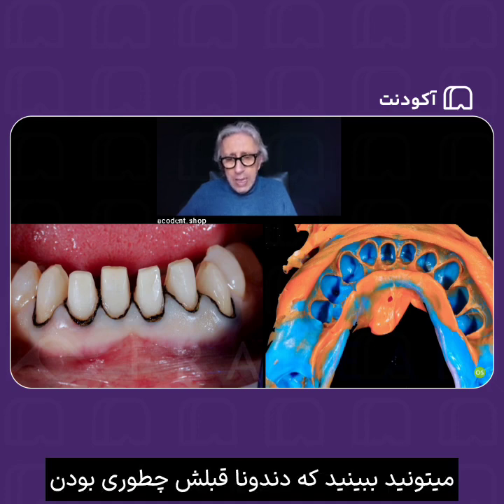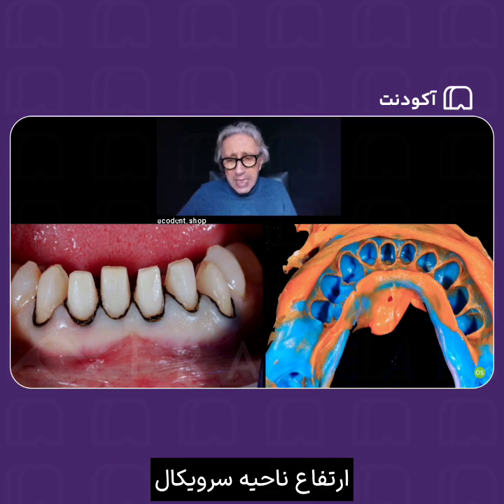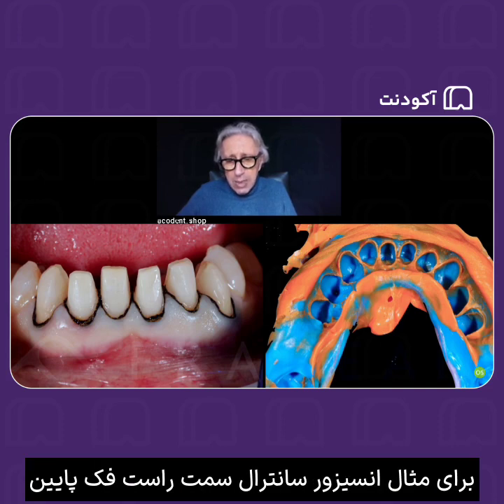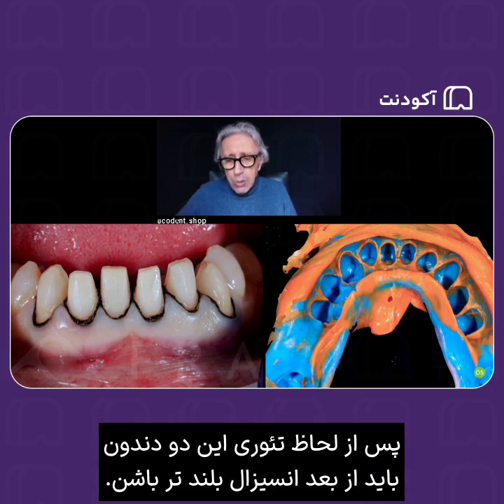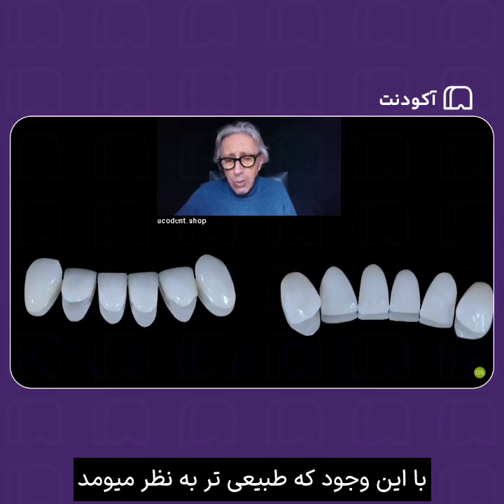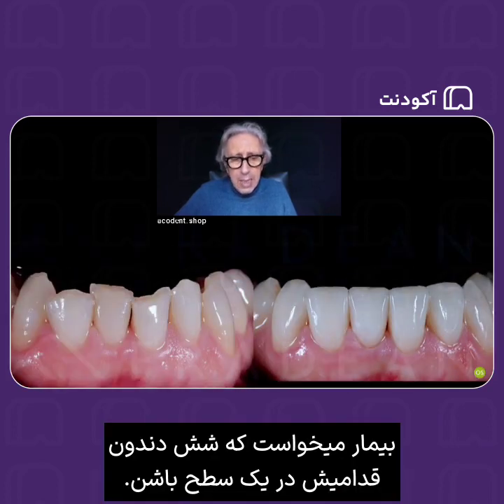And you can see how the teeth were before. Look at the cervical area, the cervical height. And you see that, for example, the central incisor of the right side on the lower arch was more in, and the cervical margin was at a higher level than the others. So theoretically, this tooth should be at a higher level also incisally. But the patient didn't want it, even though it was more natural. And the patient wanted to have the 6 anteriors completely at the same level.